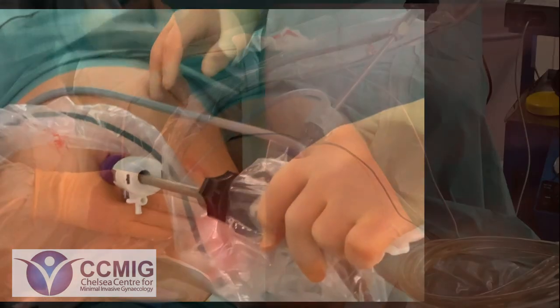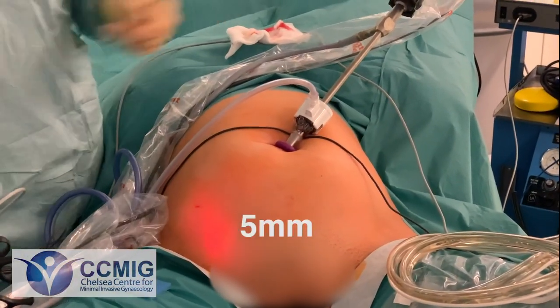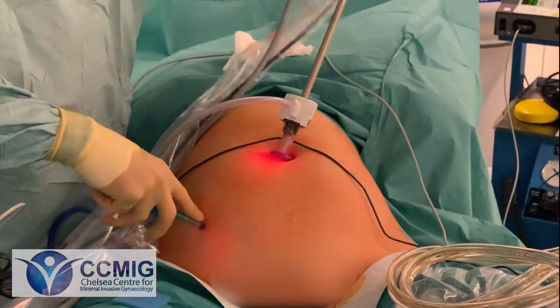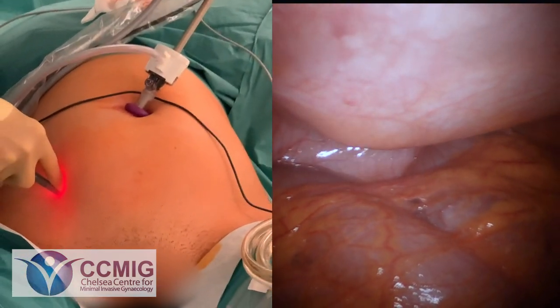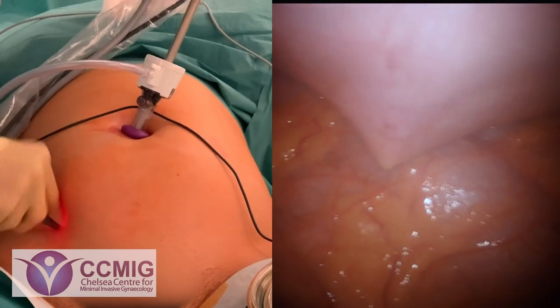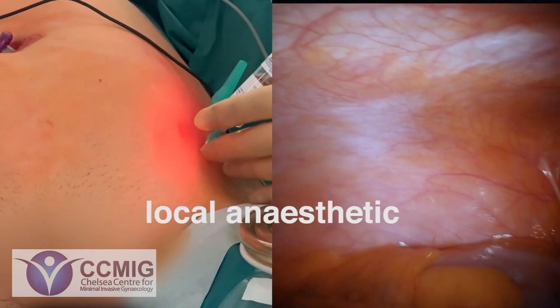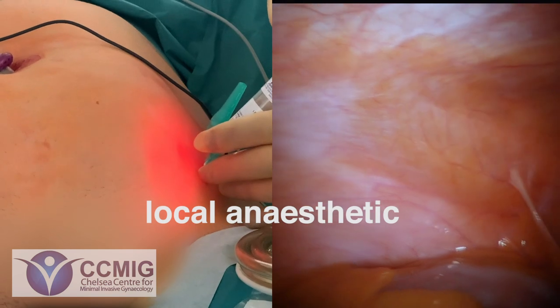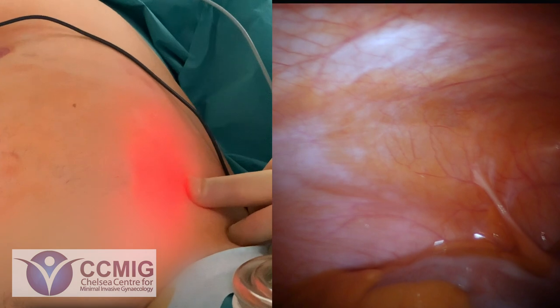So now it's time to place one of our lateral ports — a port on the side. This is about a five millimetre incision, so half the size of the original port. We use a very similar, albeit smaller, device but this time you can watch it go in really carefully to make sure there's no risk of any damage to anything beyond. You can see that port there entering through the front of the abdominal wall with bowel beyond. This is local anaesthetic going in now — you'd think the patient is under general anaesthetic, but actually having local anaesthetic reduces the amount of anaesthetic drugs the patient needs, therefore has a lower risk of side effects like drowsiness or vomiting afterwards.